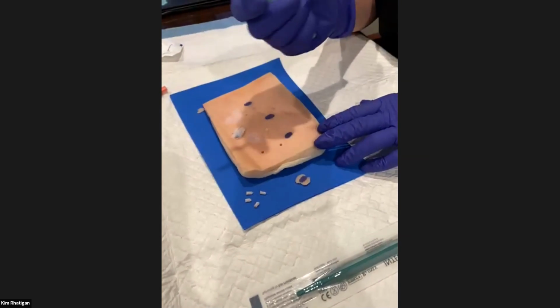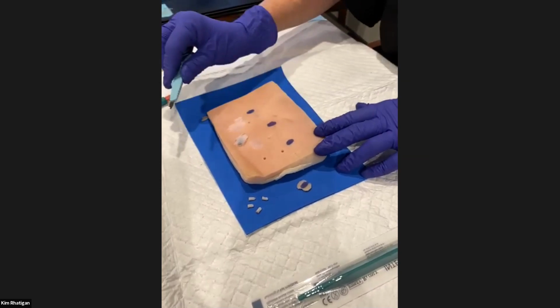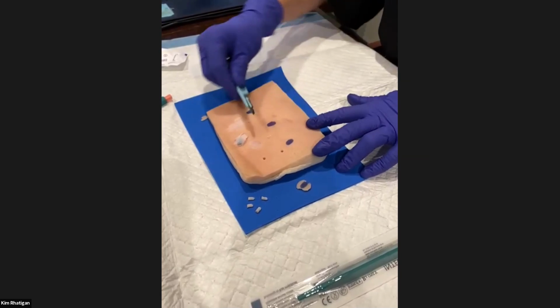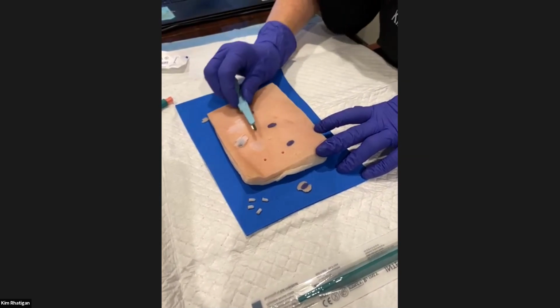Okay, so with the scalpel, I recommend cutting away from you, Dr. McClain. Is that a correct technique? So instead of me cutting towards myself, I was taught to go this way.